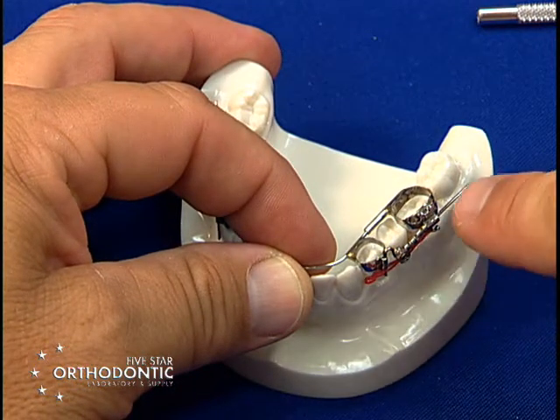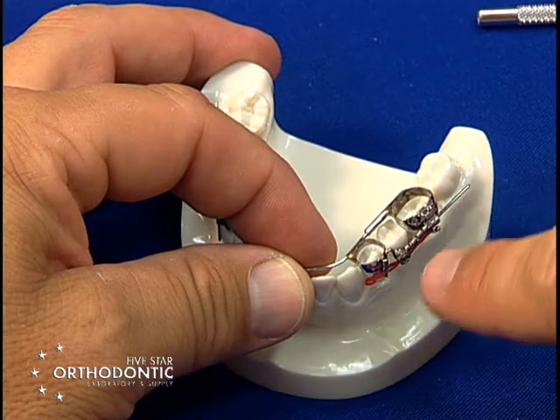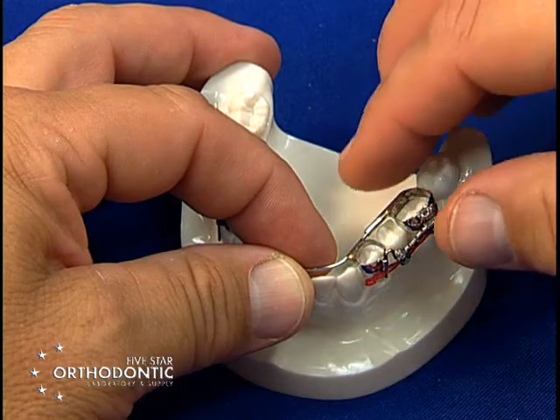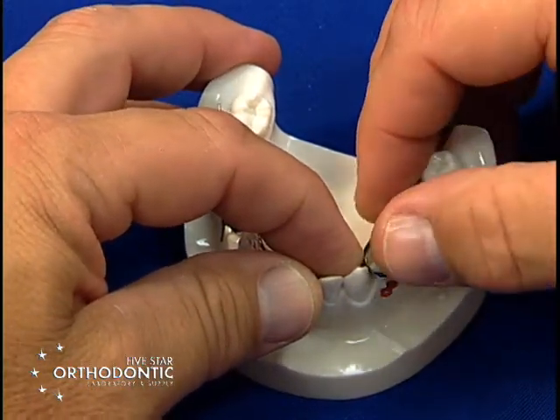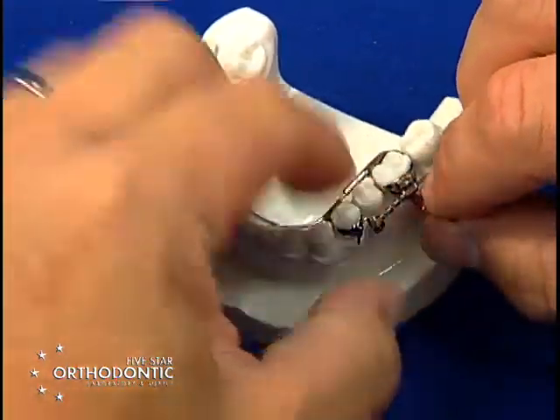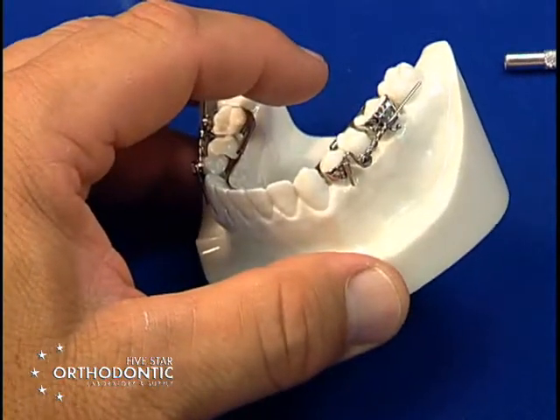You can place all at once with the distal arm coming out of the buccal tube. Also, the arm coming out of the hollow tube on the bicuspid will hold the wire in place. Then you seat the appliance. As you seat the appliance, you can remove the chain elastic. And then you'll need to secure the appliance.